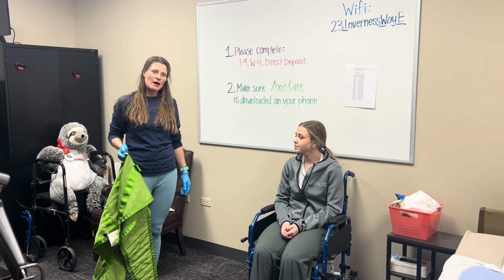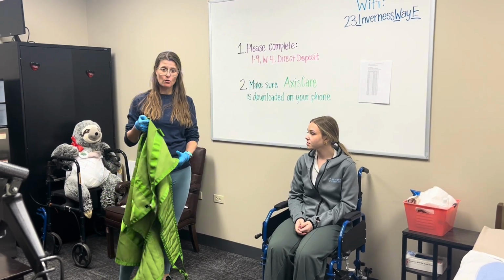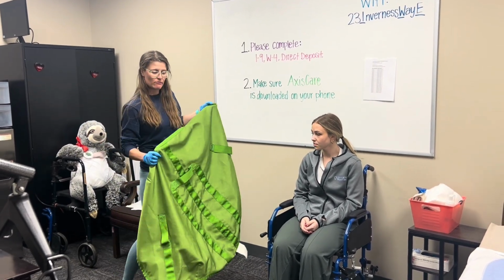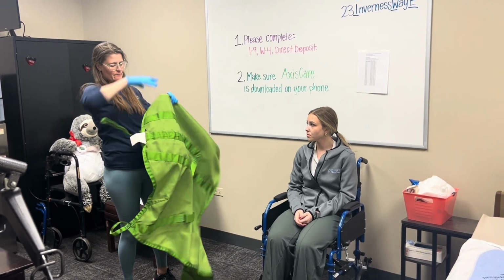Yes. Okay. My bedbound client needs to get back into bed and she cannot do a transfer on her own. And so I'm going to use a Hoyer sling and a Hoyer to help her with that. We've been sitting in the chair for a while and I took out the sling because it is the best for her skin. So now that she's sitting, I removed the leg rest and I'm going to find the top part of the sling right here.